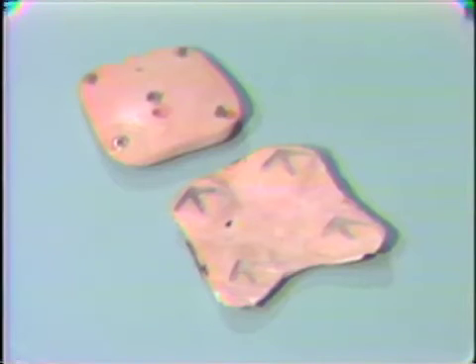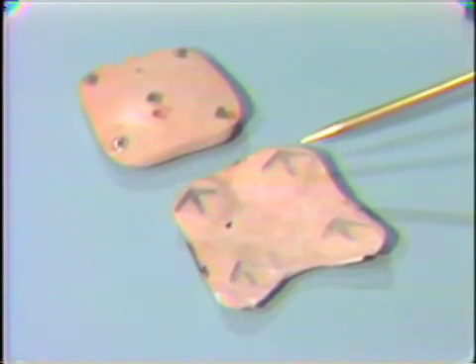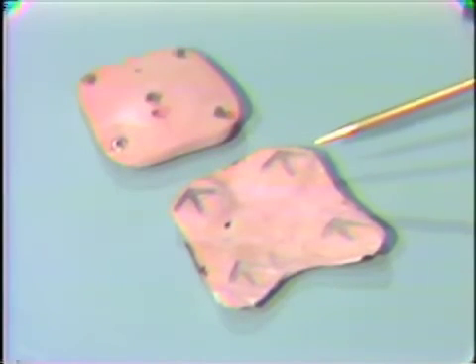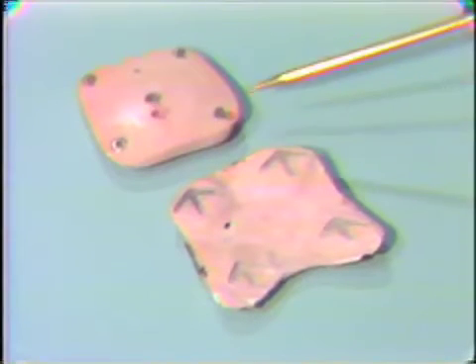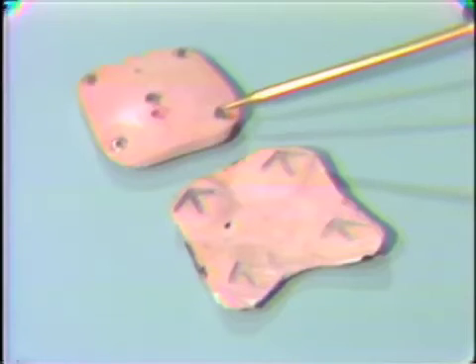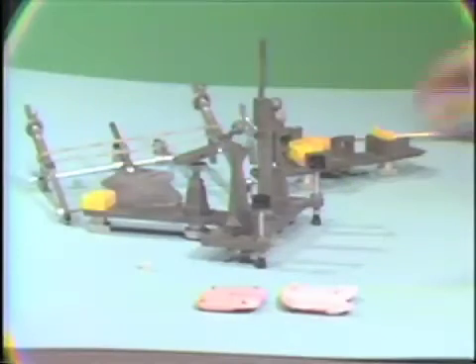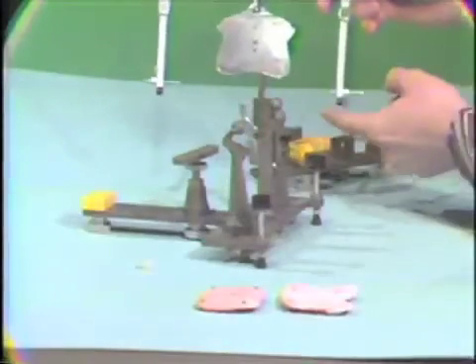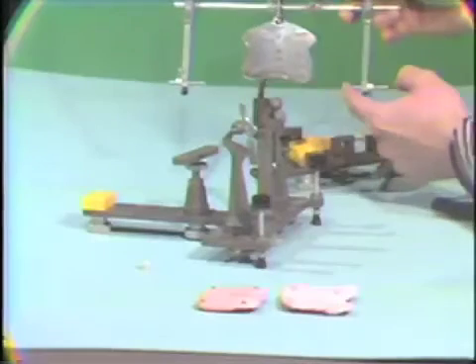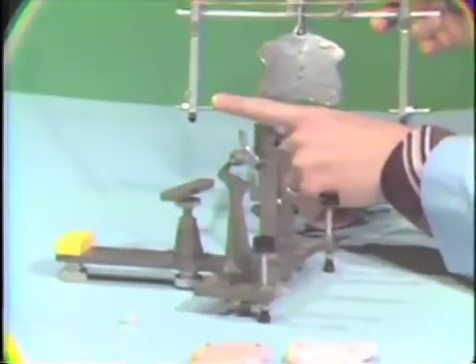Now that we've completed our second stereographic recording on the patient, we've gone ahead and reduced all the contacting areas on this clutch except for just those areas contacting the cutter studs, as you see here. We don't want any contact with the opposing clutch other than just with the cutter stud, these little cutters here. Okay, we've also gone ahead and taken our face bow off the patient using our clutches. Okay, we've aligned our side arms here, our little pointers, over the hinge axis recordings that we took earlier.